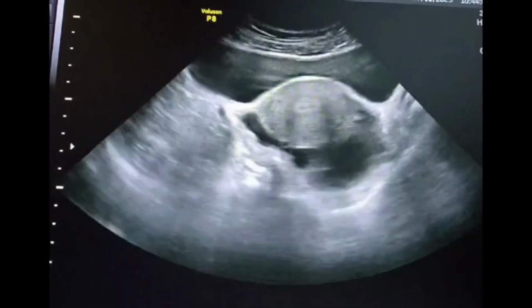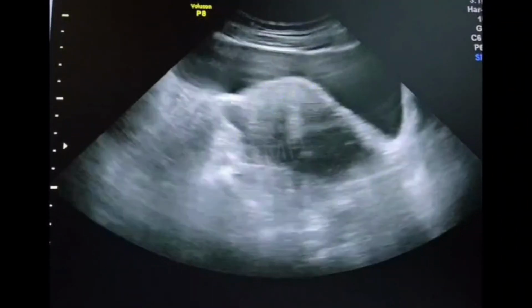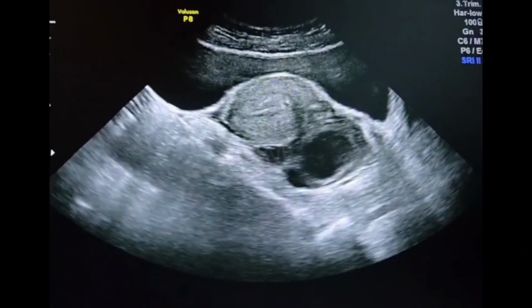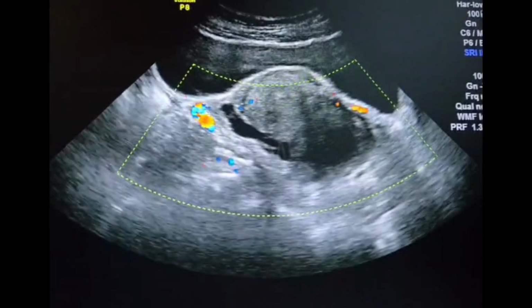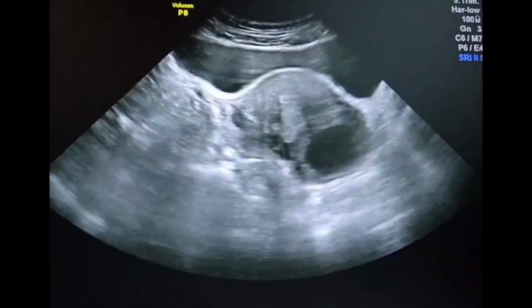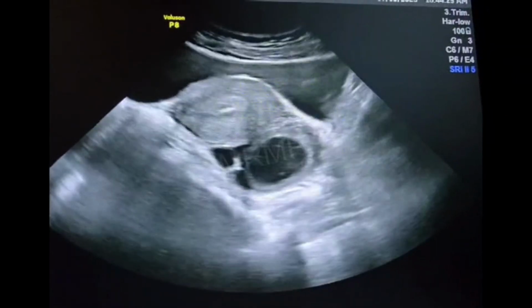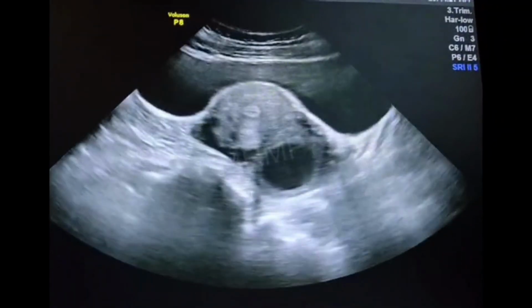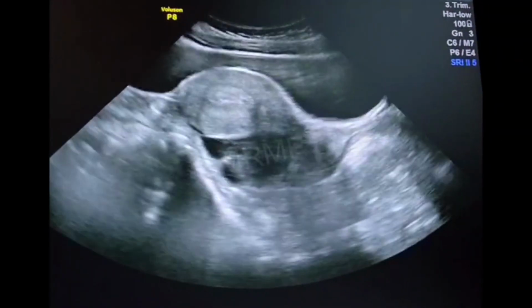Welcome to the surgical demonstration on hysteroscopic polypectomy using hysteroscopic scissors. We begin with a transabdominal ultrasound showing a well-defined hyperechoic lesion within the endometrial cavity, suggestive of an endometrial polyp. Note the central vascularity and well-preserved endomyometrial junction, which are typical features supporting a benign etiology.